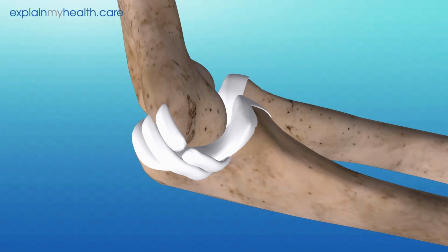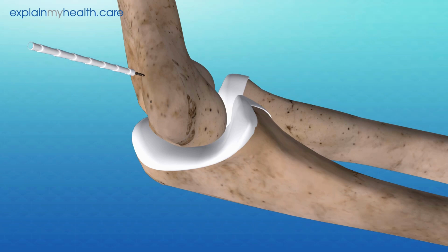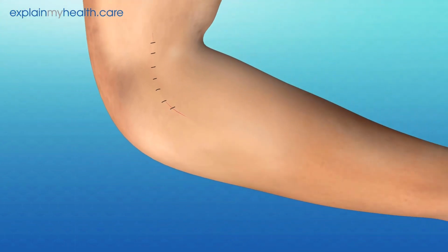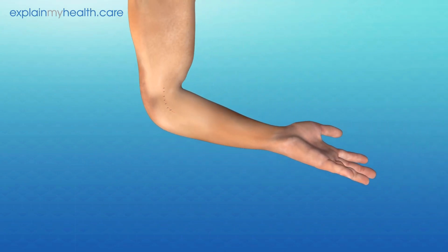Not all of the tendon is removed, so it will still continue to function. Holes are drilled into the elbow bones, and the graft is passed through these and secured. The skin is then closed with sutures or skin staples.